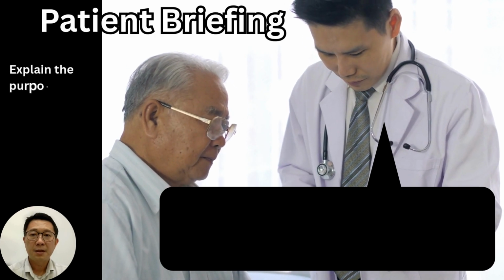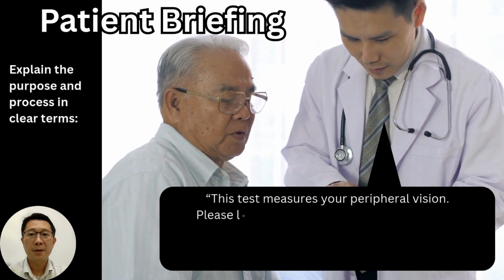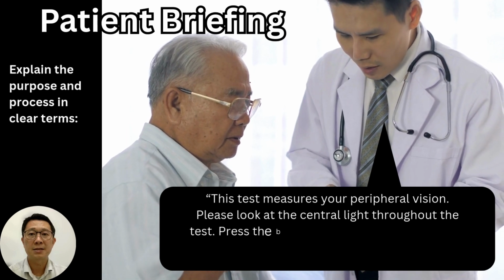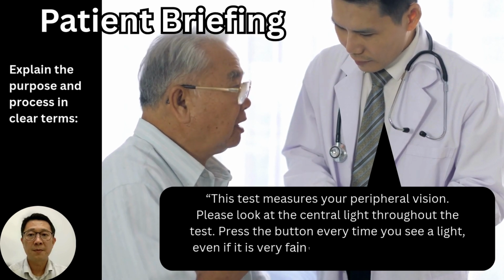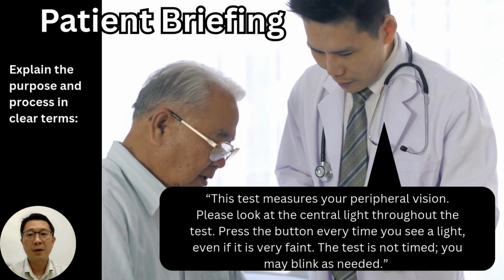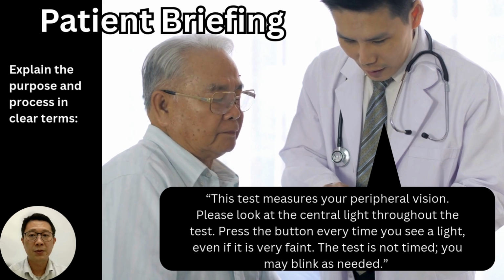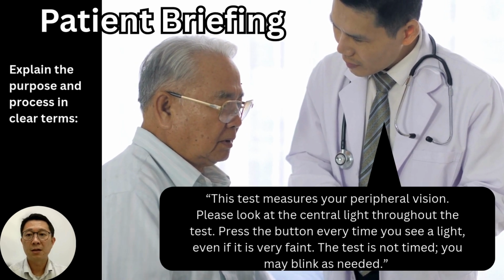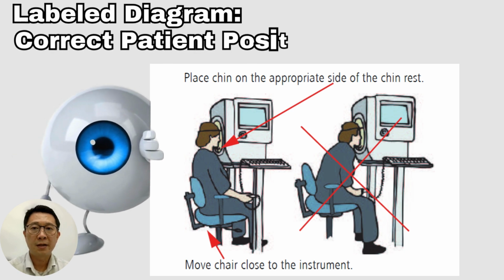About patient briefing, also explain clearly to the patient: this test measures your peripheral vision. Please keep your eyes focused on the center light for the entire test. Press the button every time you see a light, even if it appears very faint. The test has no timer, so you can take your time. This instruction helps the patient understand the procedure, stay focused, and respond accurately, which improves the reliability of the visual field result. Now, let's look at the diagram.